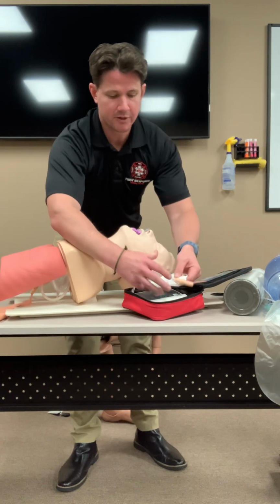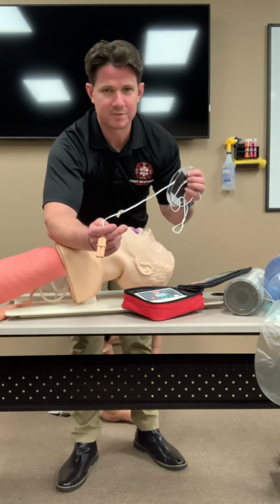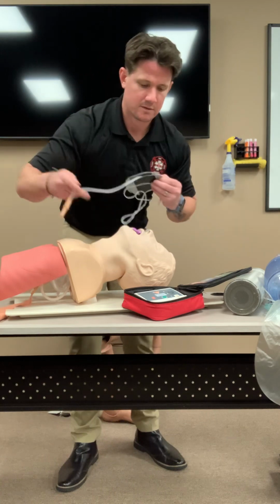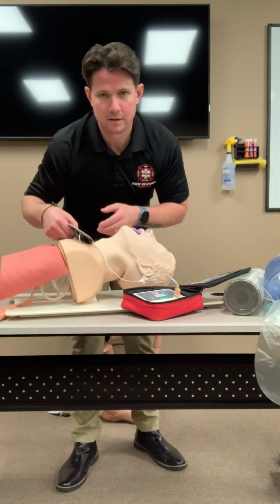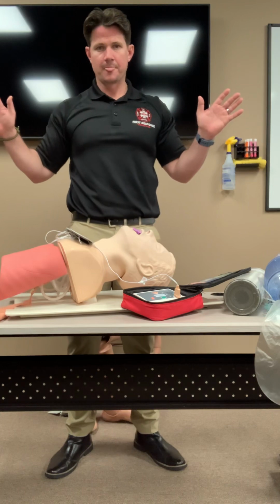The very first thing we're gonna do, as you all know, is turn it on, right? And follow the prompts. Apply pads to patient's bare chest. So we're gonna apply the pads. Pads connector next to flashing light. We're gonna plug in the pads. Analyzing heart rhythm. Do not touch the patient. Stop touching the patient. I'm clear, you're clear, all clear.